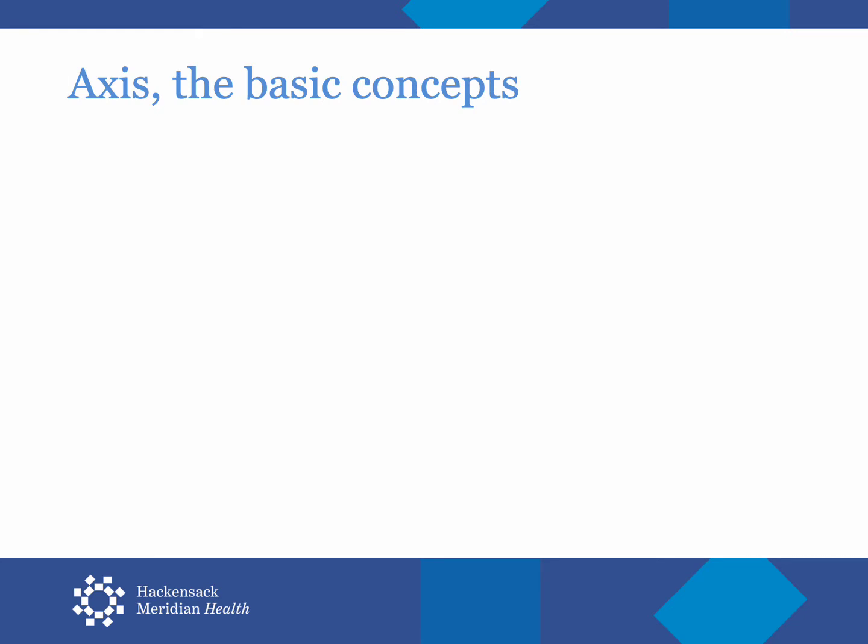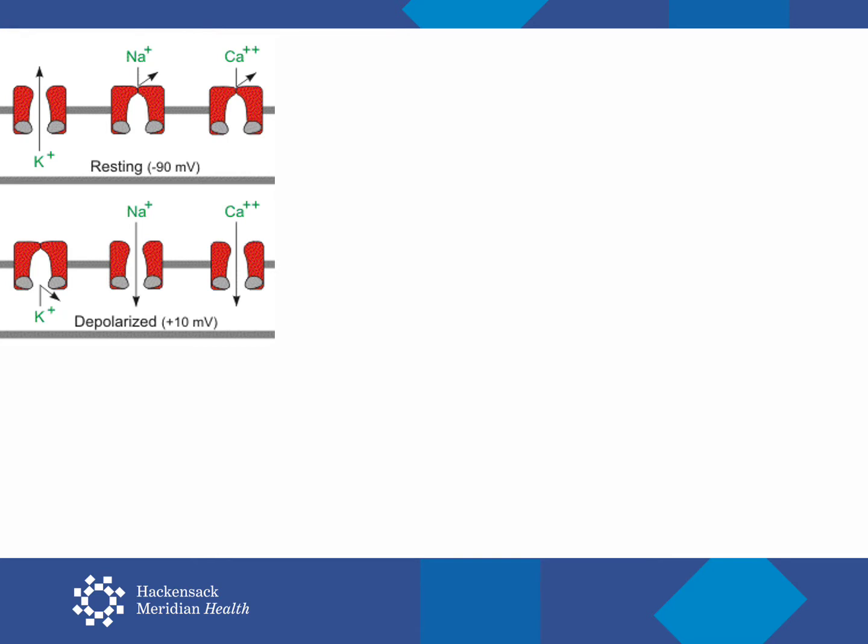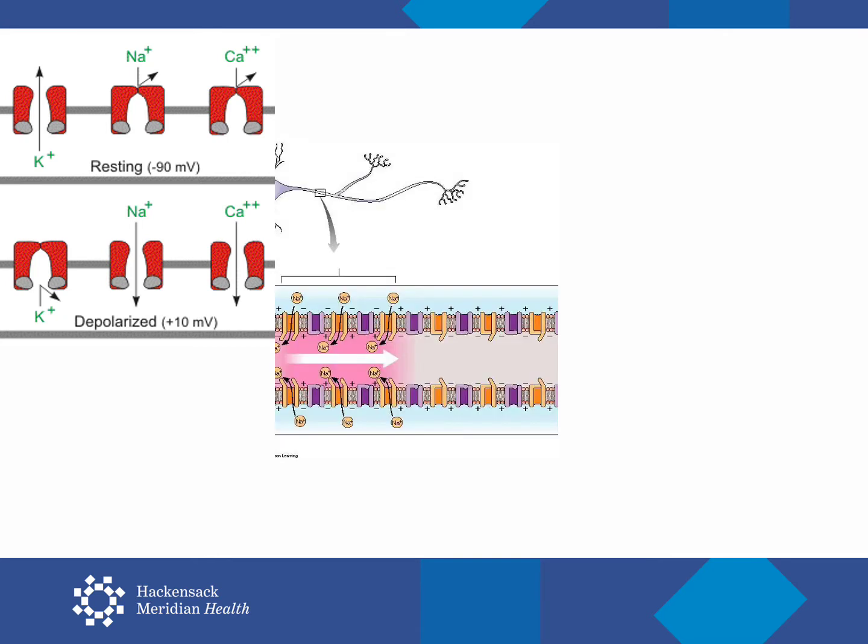First, let's go over some really basic things. Remember that resting myocardial cells have a negative charge. As the cells depolarize, the change to a positive charge comes down across the precordium in the direction of the heart's depolarization.